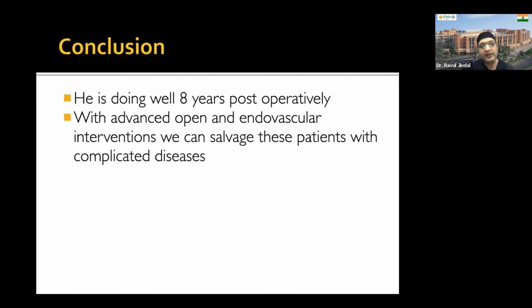I could not get the slides, but this patient came back 2 years later, in 2017, with an aneurysm from the lower end of the aortic stent. Now the infrarenal aorta was aneurysmal. So what we did, we reimplanted the inferior mesenteric artery into the left common iliac artery and then extended the stent into the aortic bifurcation.